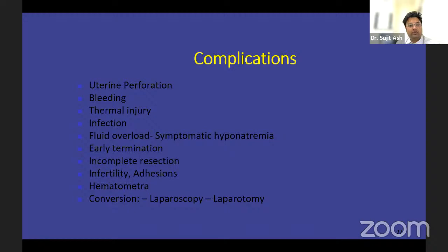So the advice would be always do an electrolyte level before the surgery, in a situation where you are expecting that there might be fluid overload, and you'll do a proper charting of the fluid. How to manage your fluid, I'll be discussing towards the end, where I have a small presentation on that. You need to plan termination of the procedure early if you're thinking that there might be fluid overload or there are some complications which have happened.